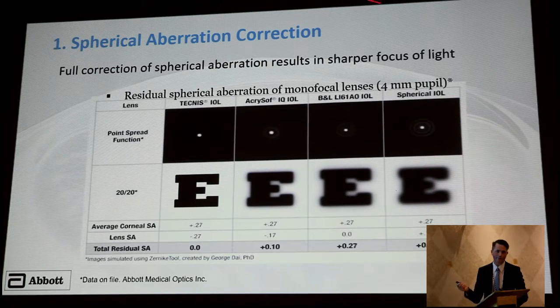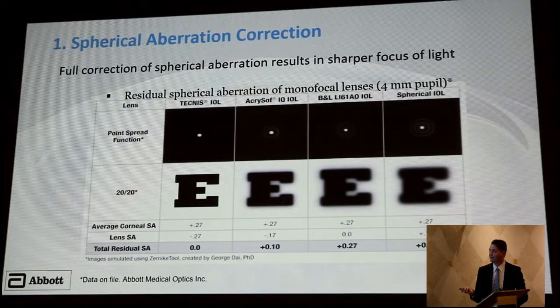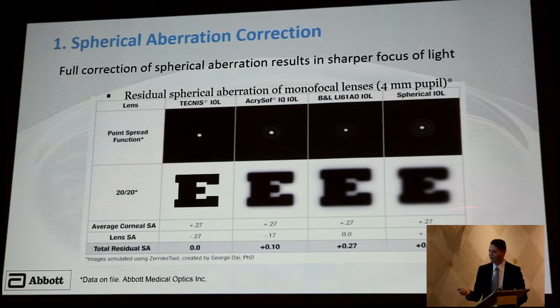So this is your $20 lens given to you by the government. And this is potentially how your patients are going to see. So when you're recommending that your patients upgrade, as I do to every patient, even if they're diabetic with macular edema and they've got macular degeneration and they're a terrible refractive patient, you still don't want to give that patient this defocus, and the cost of upgrading the lens is minimal.